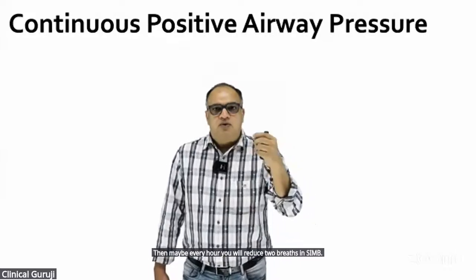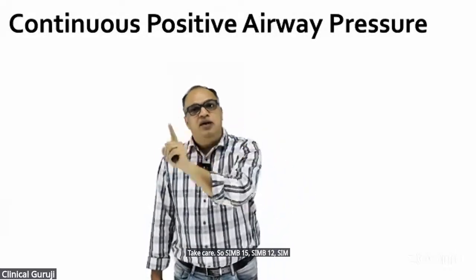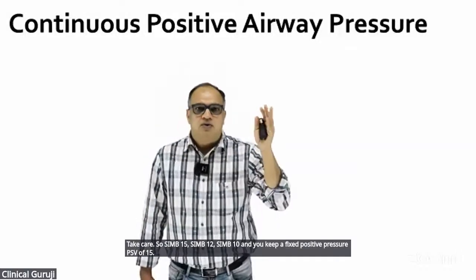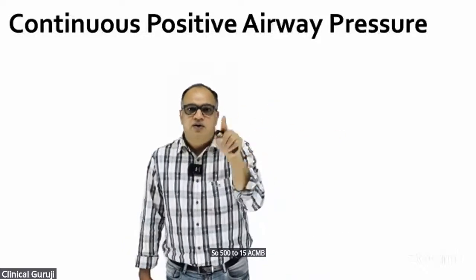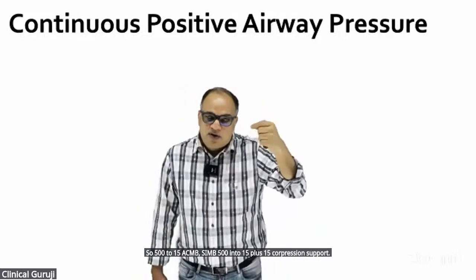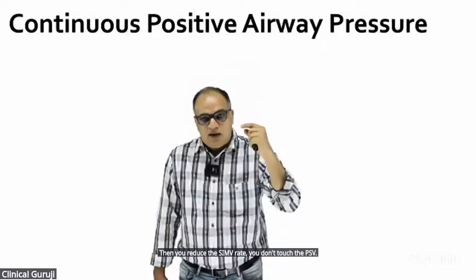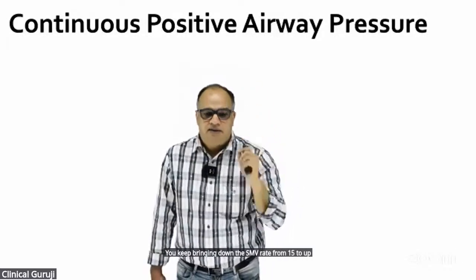SIMV 15, SIMV 12, SIMV 10, and you keep a fixed positive pressure PSV of 15. So 500 into 15 ACMV, SIMV 500 into 15 plus 15 pressure support. Then you reduce the SIMV rate, you don't touch the PSV. You keep bringing down the SIMV rate from 15 to up to 7 or 8.